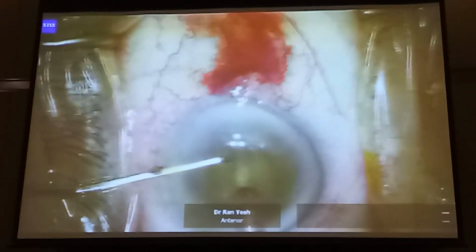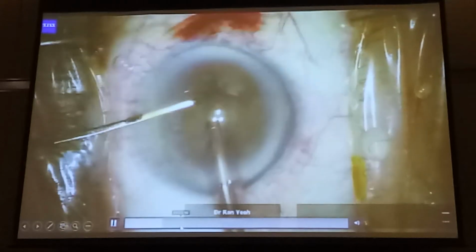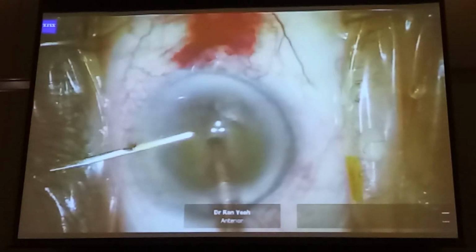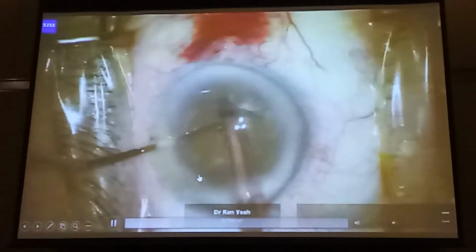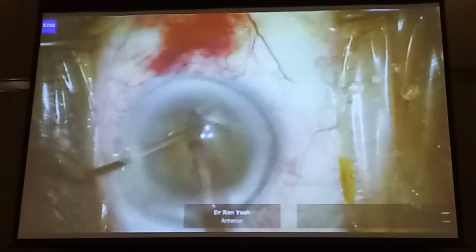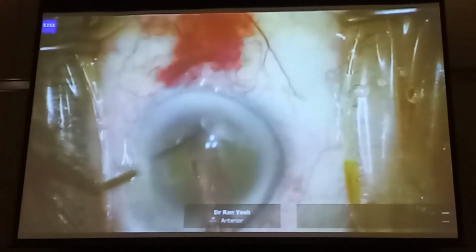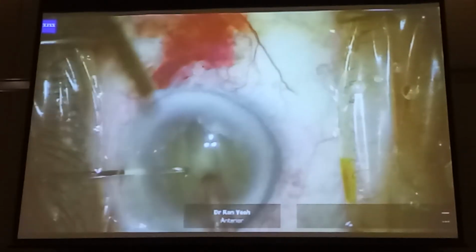Let's see if I can move this on a little bit more. Okay, so here she is. She's about to try cracking it now. And with these soft ones, you need to be very deep, otherwise it won't crack. And here she's trying. Now that's not a nice feeling. When you've got a soft cataract, you're trying to push it apart, it doesn't. So what do most people do?